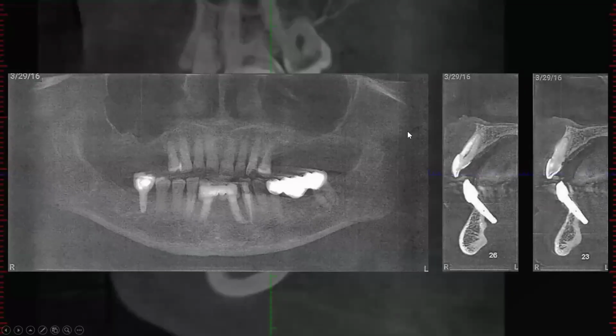but she went to some oral surgeon because they were bothering her, and he took a 3D view, and here are the implants that he placed. He's like, that's not so bad, is it? And what do you think I told him? Well, this is the worst I've seen. Looks like you were trying to cross the T rather than go into the bone. He's like, yeah, well, I've learned a lot since. I do a lot better now. So hopefully that's true.